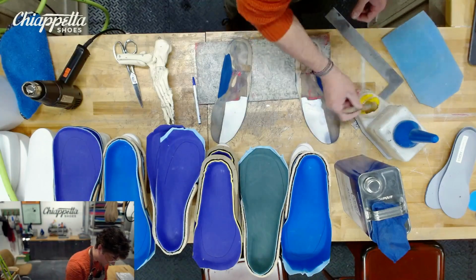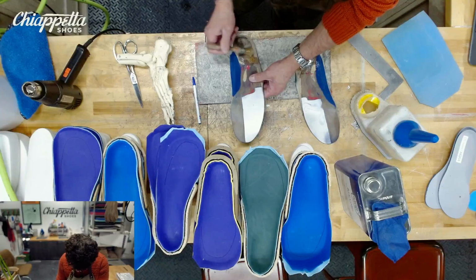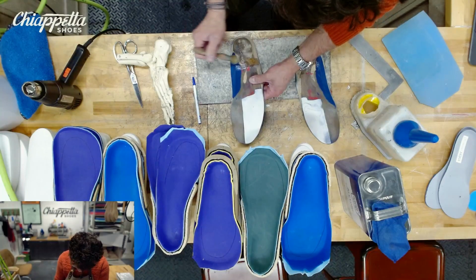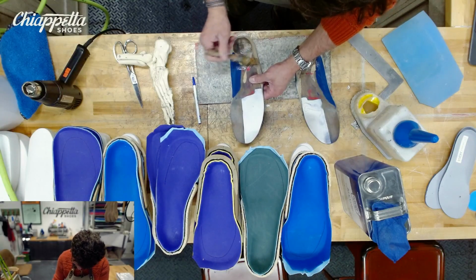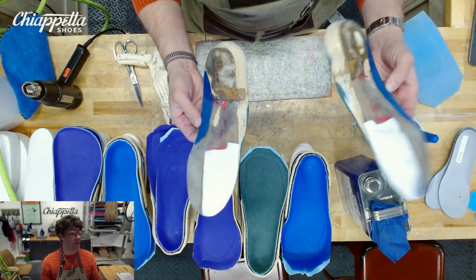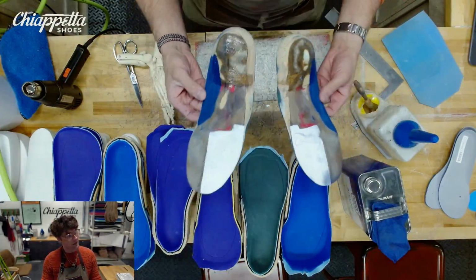So all of these little things, for any of you apprentice pedorthists out there, matter big time. Sometimes we have to go complete opposite of what we normally do, and that's okay. I'm also going to note that these orthotics are not that old, and they look like they got the shit kicked out of them. So we're going to see how this does.